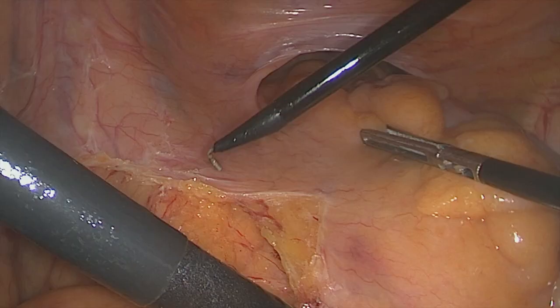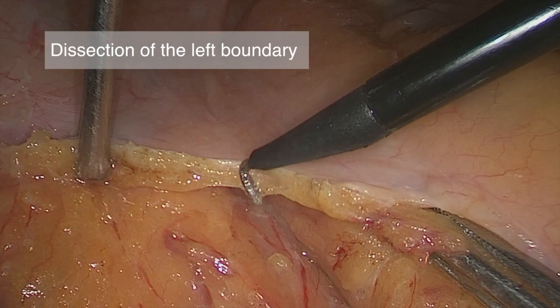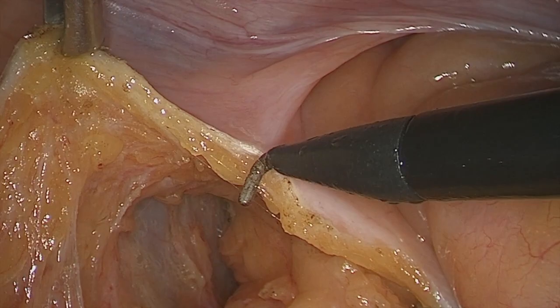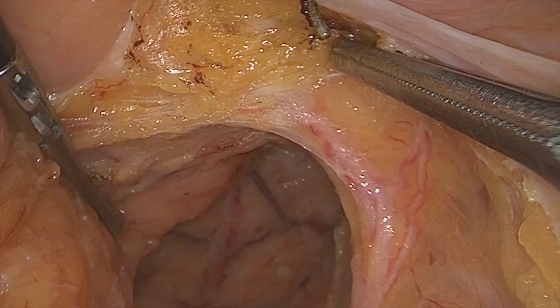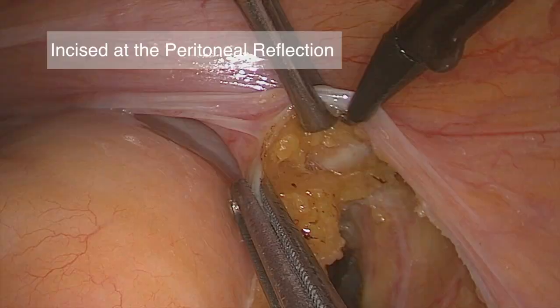Next, we move on to the left side. The rectosigmoid is now dragged towards the right as we continue to dissociate the adhesion between the left side of the rectum and the peritoneum. Incising the peritoneal reflection.